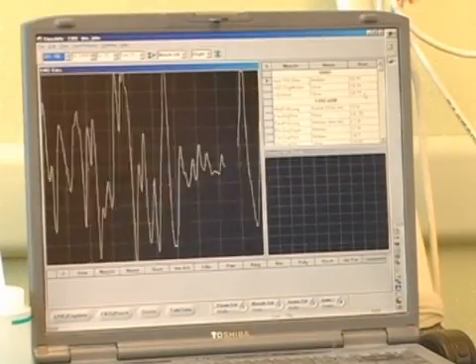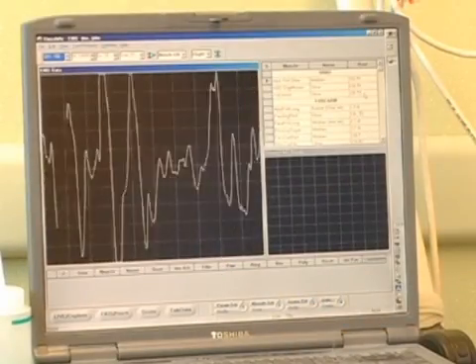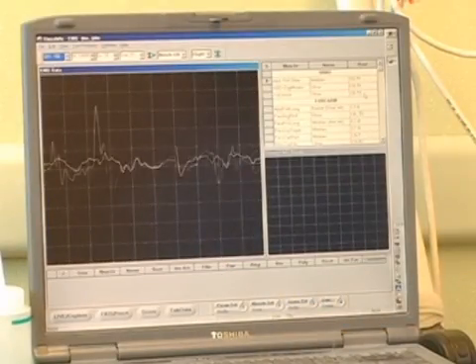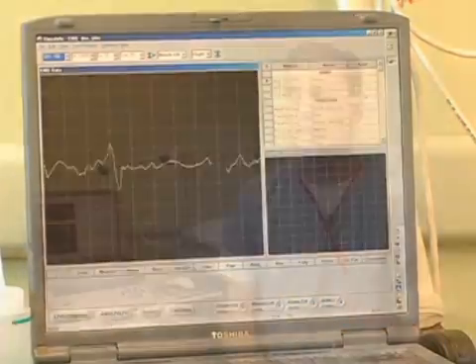I'll be looking at the computer and also listening to the computer. We turn this electrical information into sound, and that is very useful to the physician. I will be looking at a number of different muscles and all that information will be collected together.